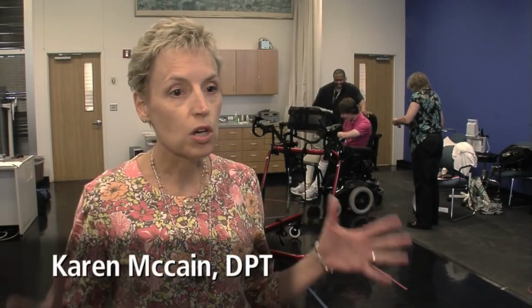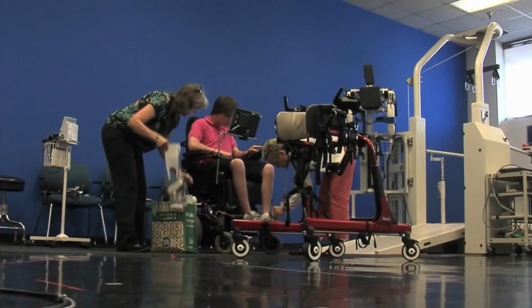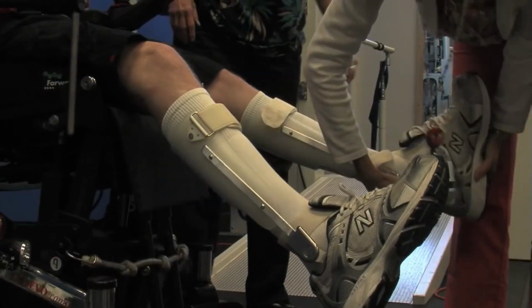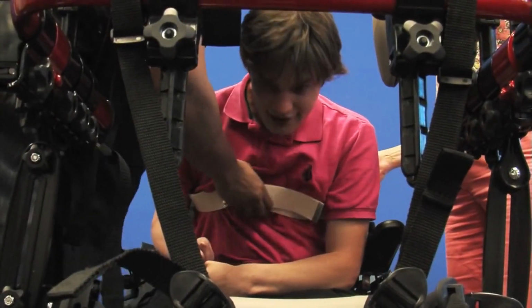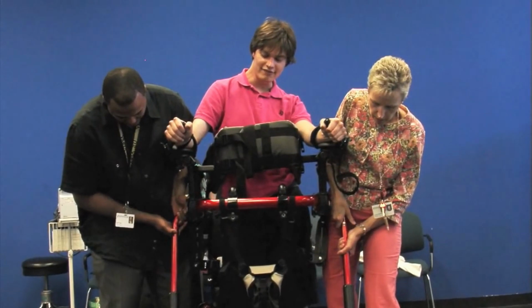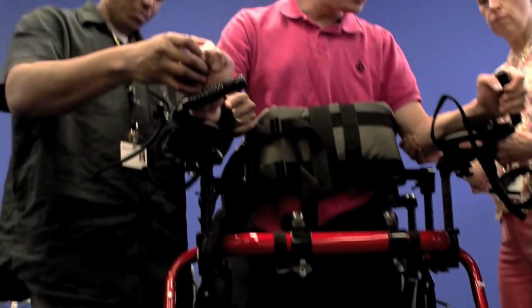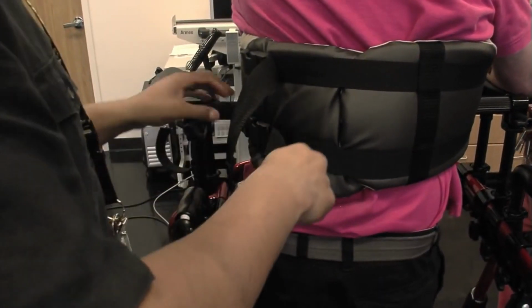It's a device that's perfect for patients like Sean because it has a lot of support, but then you can also sort of peel away the support as he gets better. It has a chest prompt, so it gives him support at his chest. It has arm supports, it has thigh supports, so it can give him all the stability that he needs, but as he gets better, I can take some of that stability away because he has the ability to move his legs, but he doesn't have the stability in his trunk and in his neck and in his upper body to be able to propel himself over ground by himself. But he needs to be able to walk a lot to be able to learn the skill. He can't do it coming to therapy twice a week for an hour. So he has to be able to walk outside of therapy, and this device will let him do that.